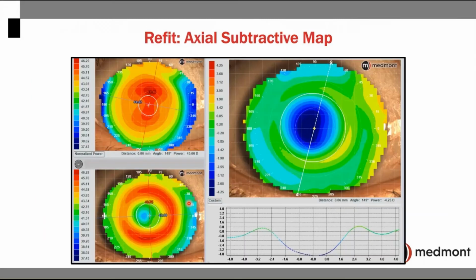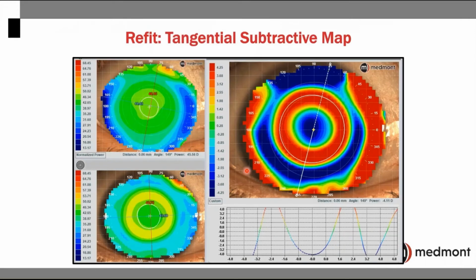In this case, we didn't have central corneal staining. We tightened up the alignment zone, and that resulted in the appropriate bullseye. Now, the blue treatment zone does appear to be a little bit high in this case, but it's still pretty well centered to this pupil. When we switch over to the tangential map, we see a red ring that really follows the pupil border. It is slightly high, if anything, but it's very much within range of what we would argue as a bullseye topographical outcome.